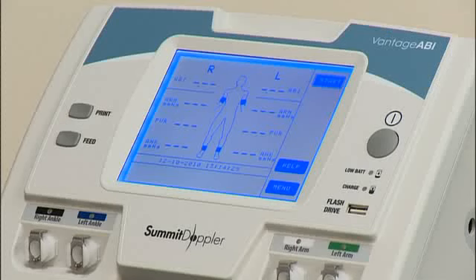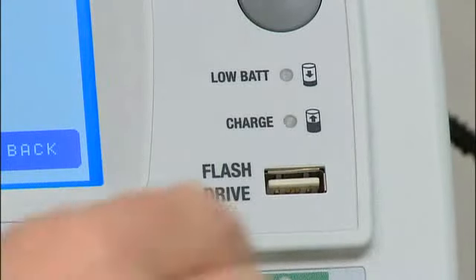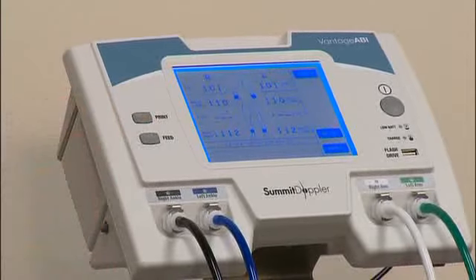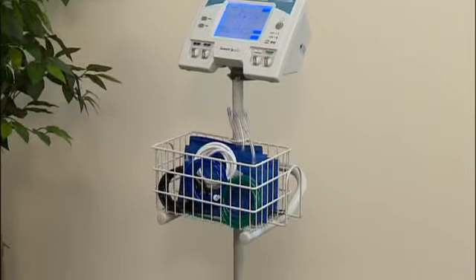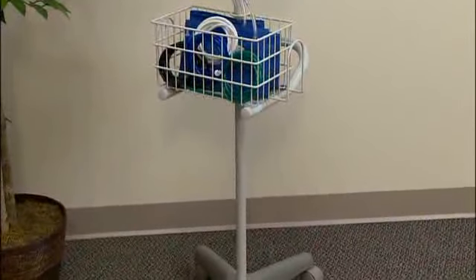It has a graphic display with a convenient, user-friendly touchscreen for navigating the system. The accompanying USB memory stick is placed in the flash drive for exporting exam data to a personal computer for easy interface with EMR systems. A built-in printer is available on some models for printing exam results on adhesive-backed label paper for easy placement on ABI assessment forms. The system is available with or without a roll stand and storage basket.